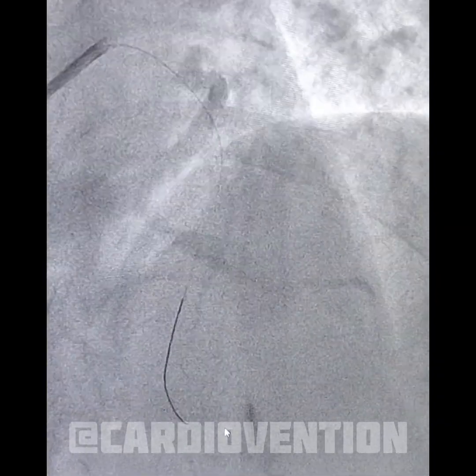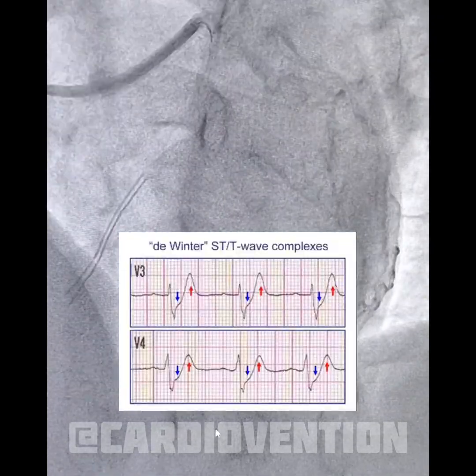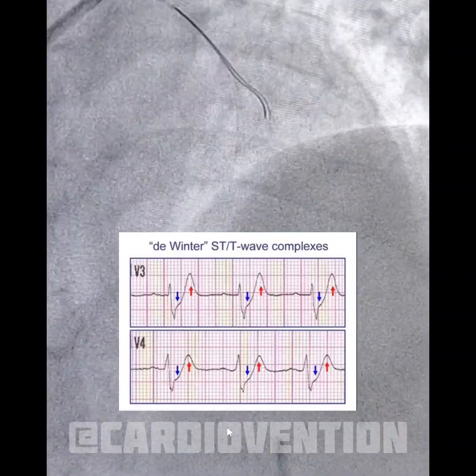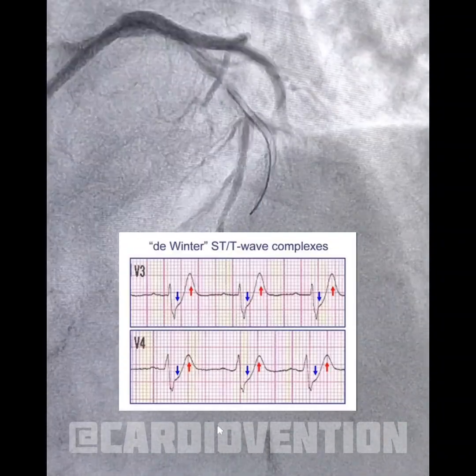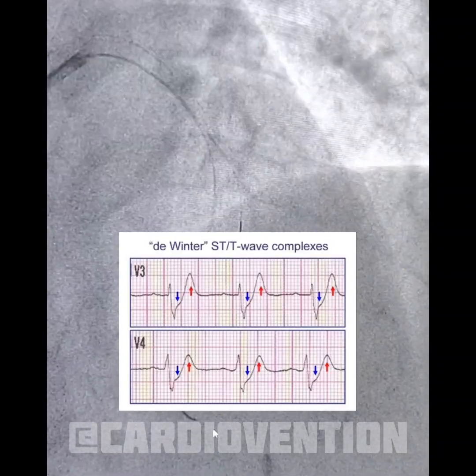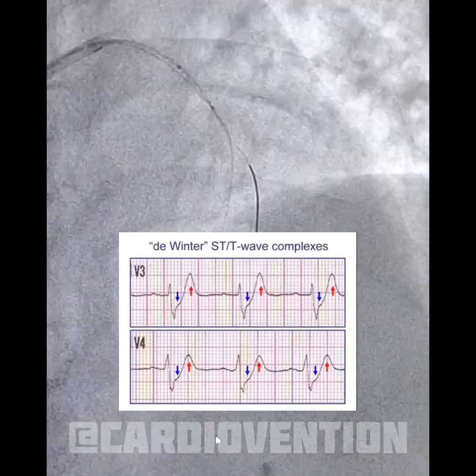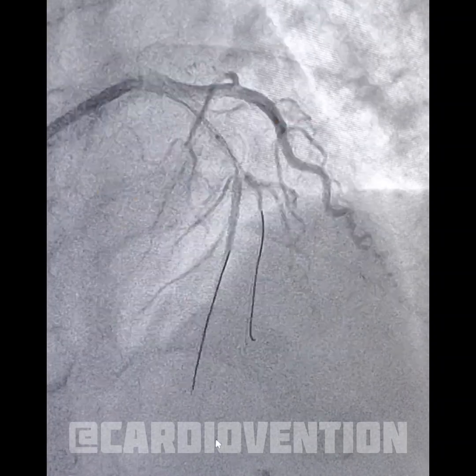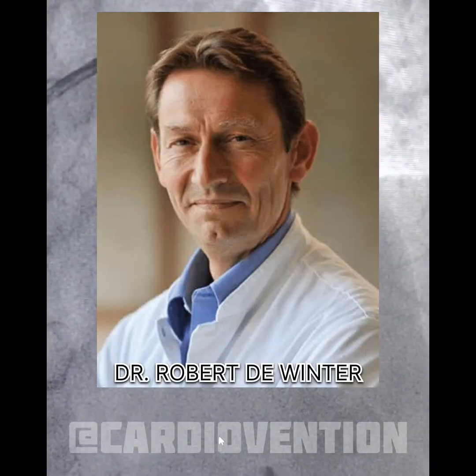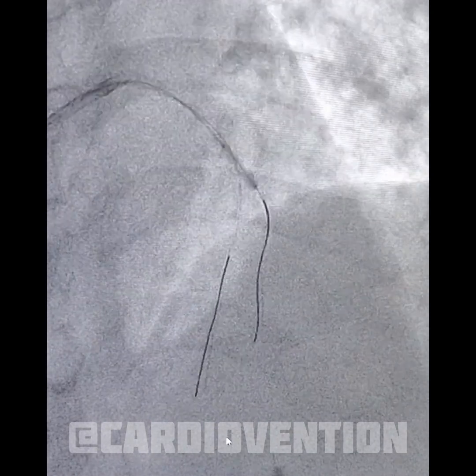and that's what we'll cover today. De-Winter syndrome refers to a specific ECG pattern seen in patients with acute occlusion of the proximal left anterior descending artery. Despite the absence of ST elevations, this pattern reflects ongoing transmural myocardial infarction and needs the same urgent management as STEMI. It was first described by Dr. Robert De-Winter in 2008 and has since been recognized as a crucial ECG finding that all clinicians should know.